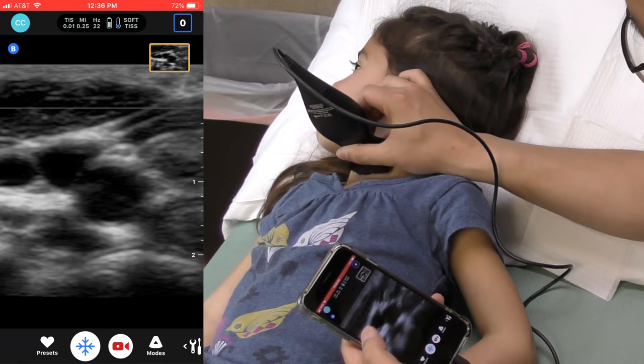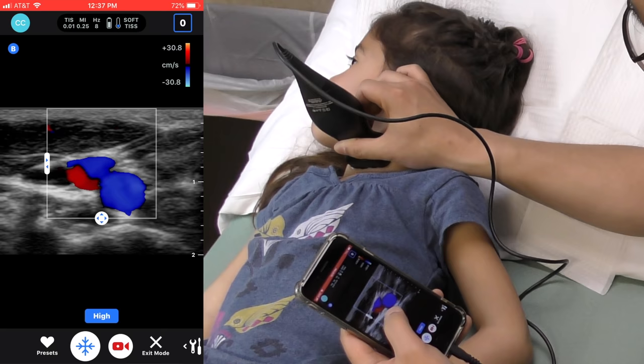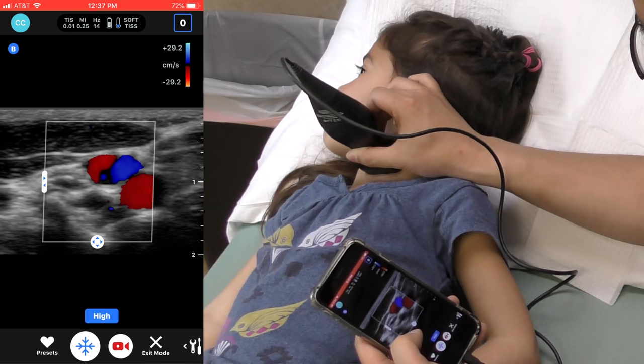Color Doppler can be obtained via the Mode button in the bottom right corner. In Doppler mode, the region of interest box size can be adjusted by dragging the borders, and Doppler gain can be adjusted by swiping side to side.